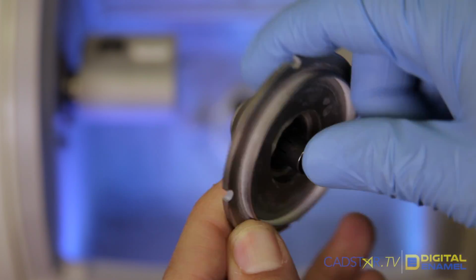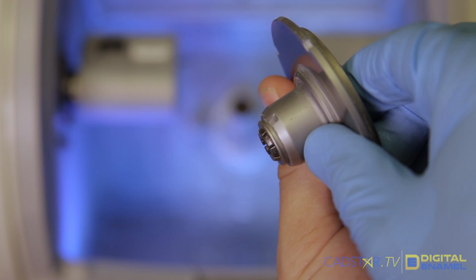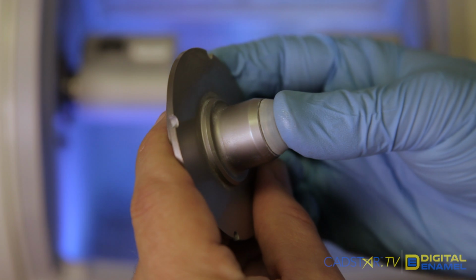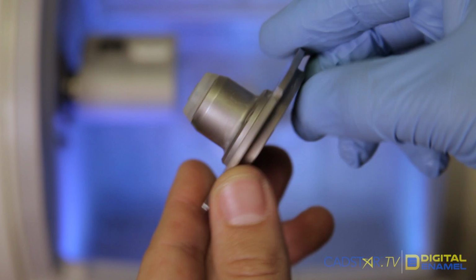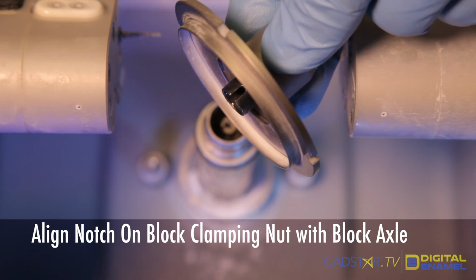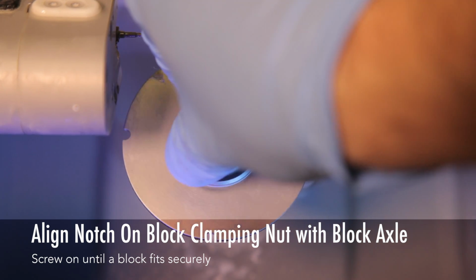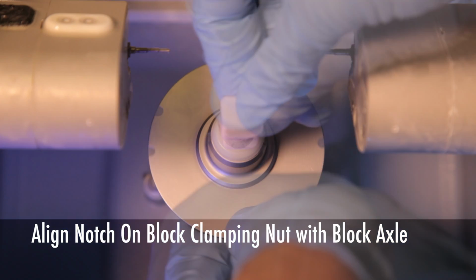So you take the chuck, place it into the block clamp, and pop it back into place. Then you take the gasket and that should pop right back on. Now that everything's put back together, you're going to want to line up this notch on the chuck with the notch on the block axle. Once the block seats, we're done. Congratulations.